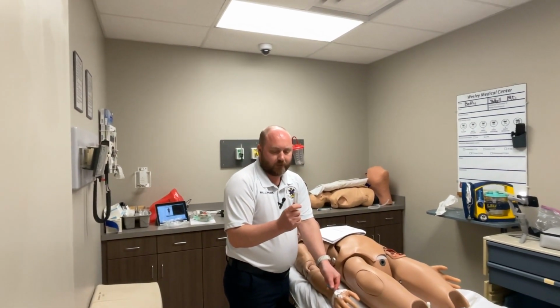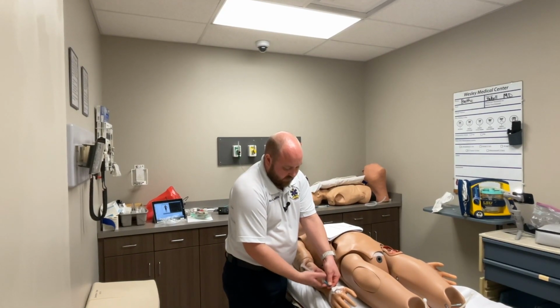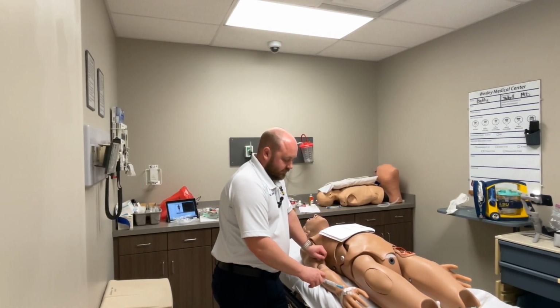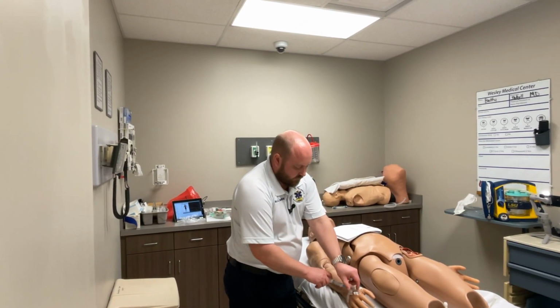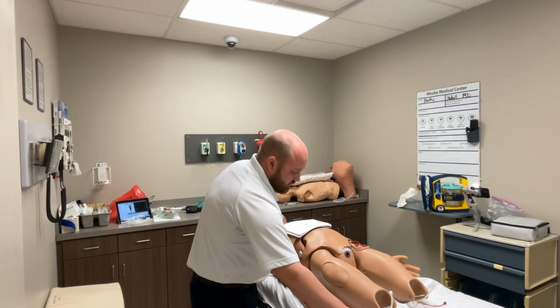And then again, when you're flushing, that flush also has to be included in that 2 to 3 minutes as well, because there's still medication in the IV that you're pushing. So we're going to push that. Once you've pushed it in, we're going to go ahead and clamp off. Dispose of your stuff in your sharps container.